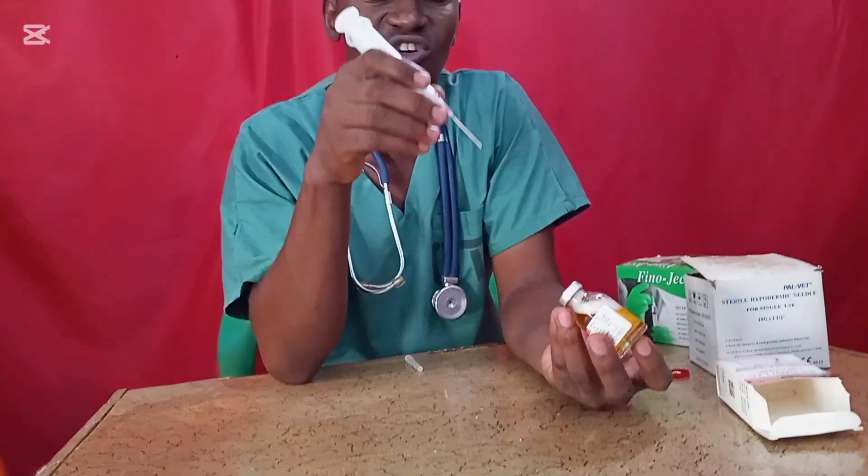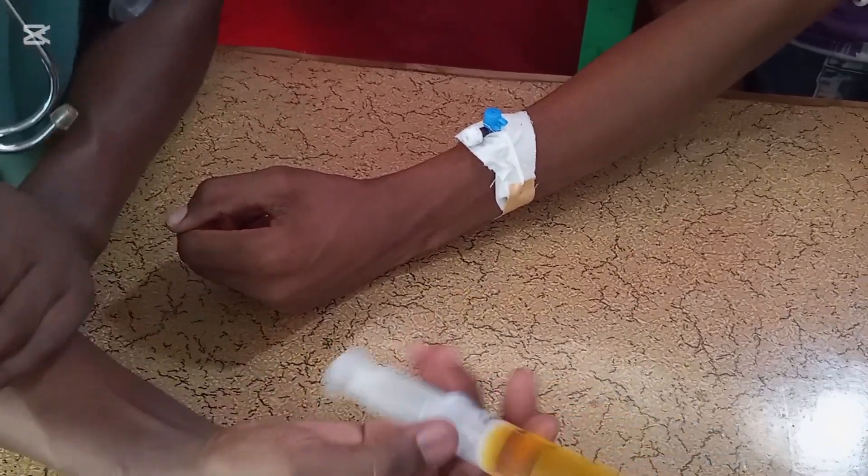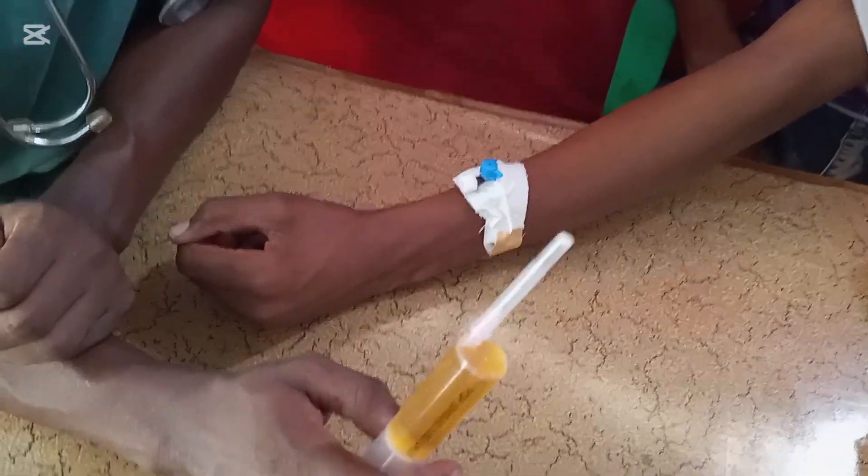Now let us see how to withdraw the reconstituted drug. Insert the needle into the vial and withdraw the drug safely back into the syringe. Before administering, remove the air bubble from the syringe. This is how you withdraw the reconstituted drug ready for administration.